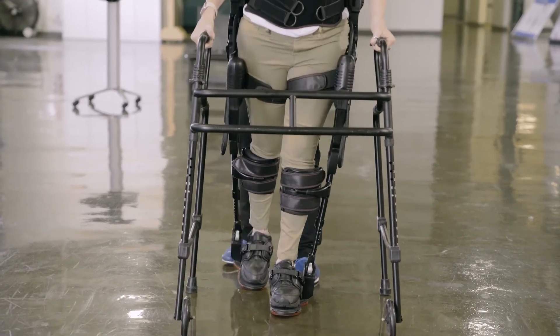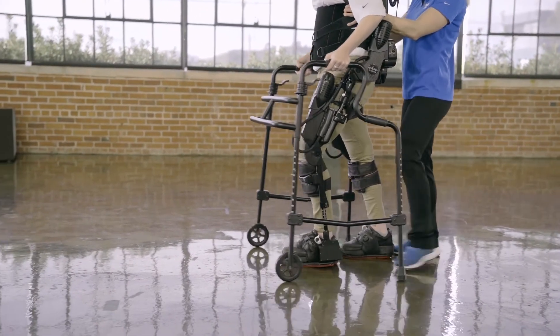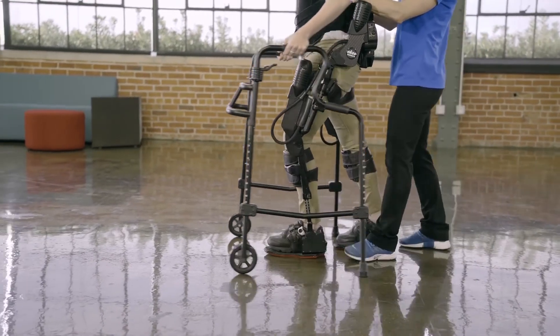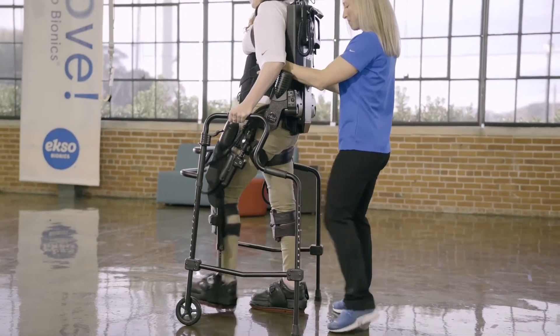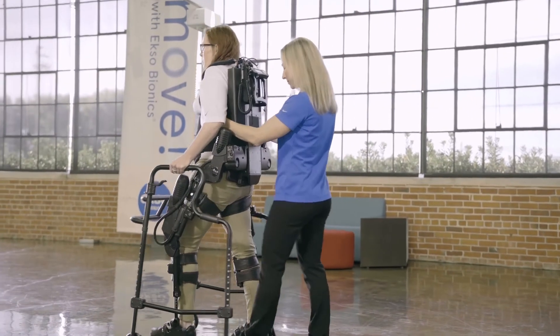In Free Gait mode, the patient has the freedom to practice walking faster, walking backwards, and sidestepping, and ultimately show the PT what they've learned while still being appropriately supported at the hip and knee with stance support. Free Gait allows for error learning and acts as a bridge to move to more efficient overground ambulation without XO.